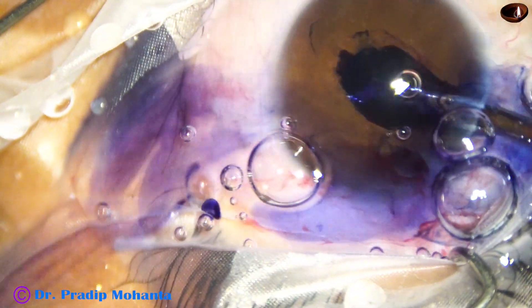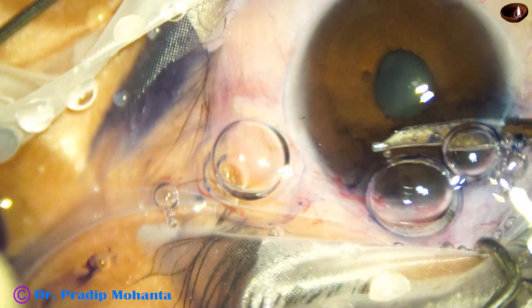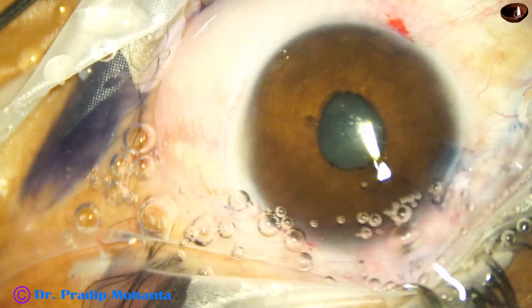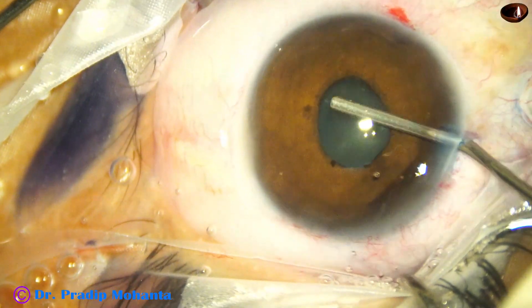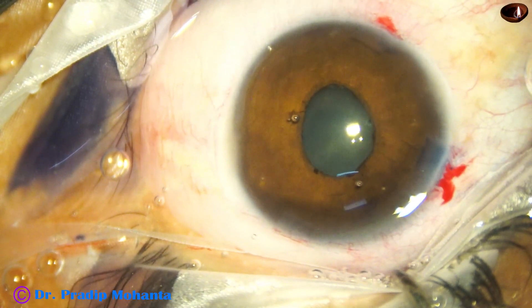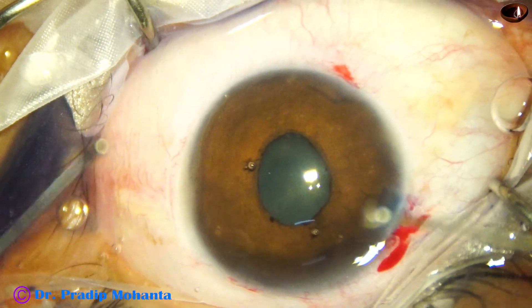And now, how to expand this pupil. The pupil expansion device that I usually use is the B-hex pupil expansion device. B-hex means Bhattacharji Hexagonal, invented by Dr. Subhan Bhattacharji of Kolkata, my close friend. And it is a hexagonal device — very flexible.